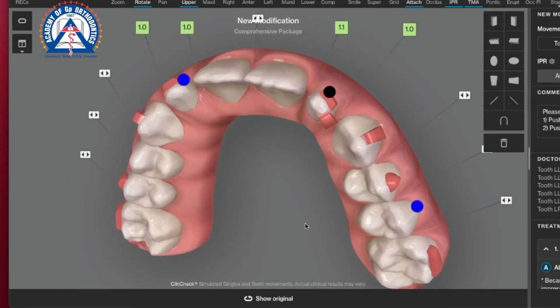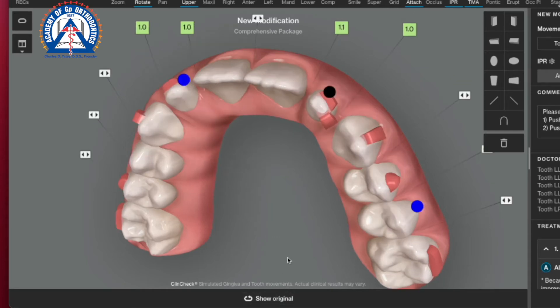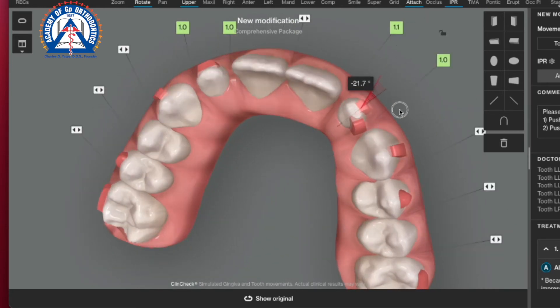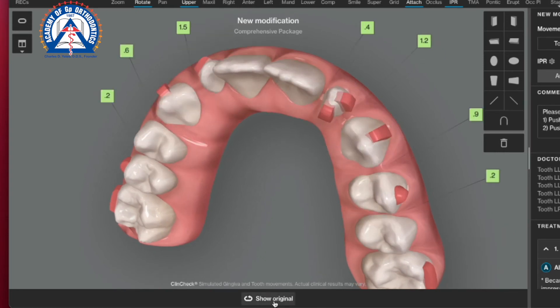Watch this — I'm going to take a vertical attachment and place it on the distal. Do you see how I created surface area out of nothing? I'm going to go on the buccal and do the same thing. I am actually creating a scenario where I have maximum surface area to be able to tack the plastic in and really push that tooth to the place I want, in the absence of a build-up. I trust this will work a lot better than what we had before.